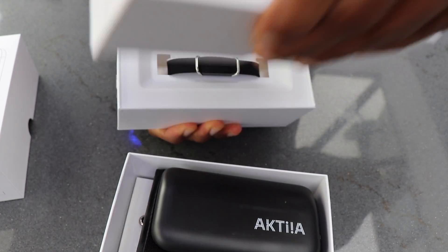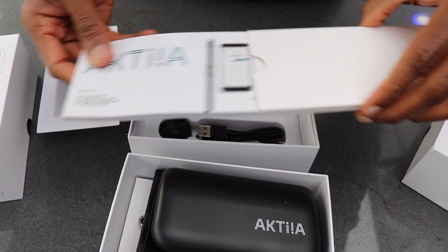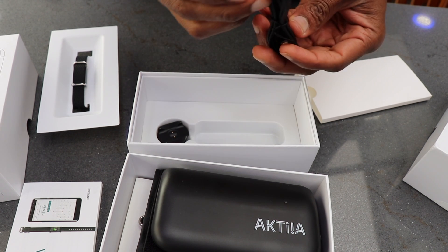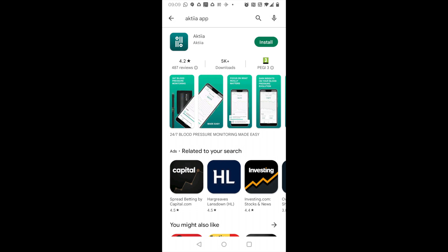Next you have the wristband, and it comes with a user manual, a USB cable, and a charger. To start the setup process you need to download the app from the app store, be it Android or iOS.